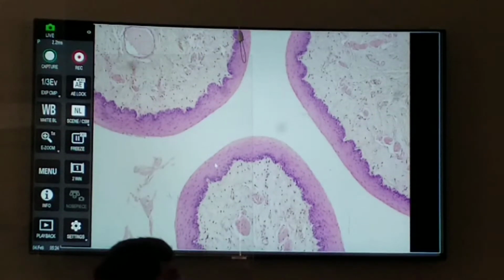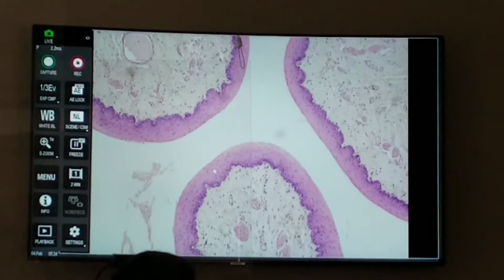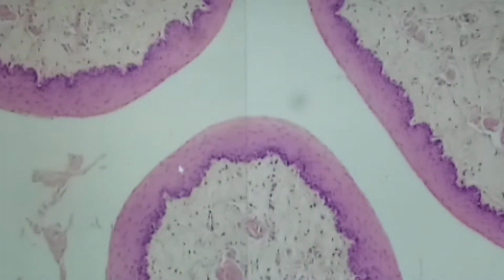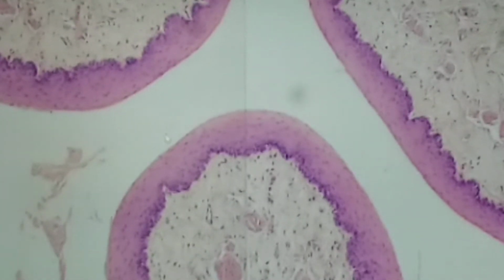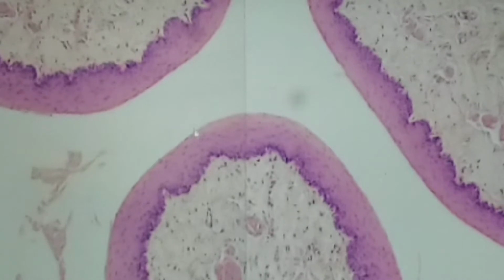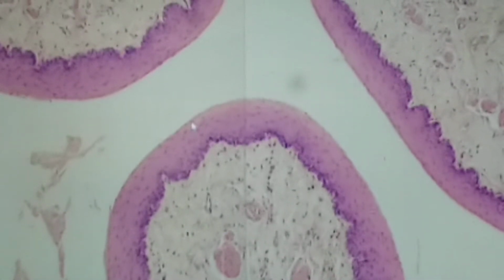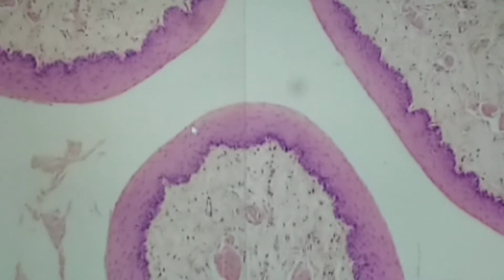It's the esophagus. We said that for stratified squamous, we use that mnemonic, skin, anus, vagina, esophagus, and mouth. We know it's not the skin because it's non-keratinized, meaning you can see nuclei all the way up to the surface. These are not dead cells. They've maintained their nuclei. So it's got to be either anus, vagina, esophagus, or mouth. Okay, it's got to be one of those.